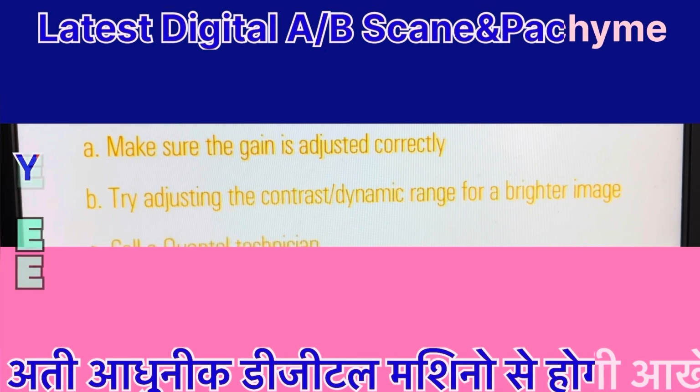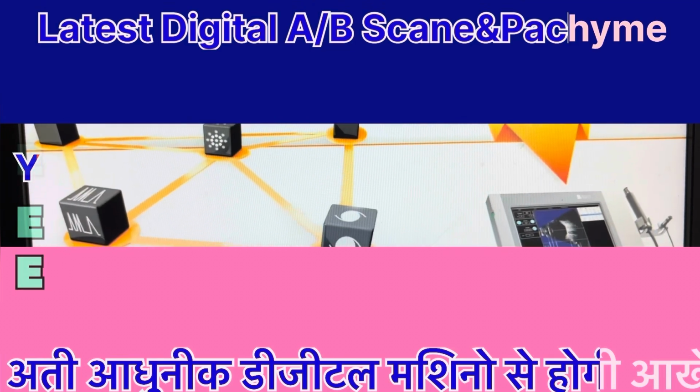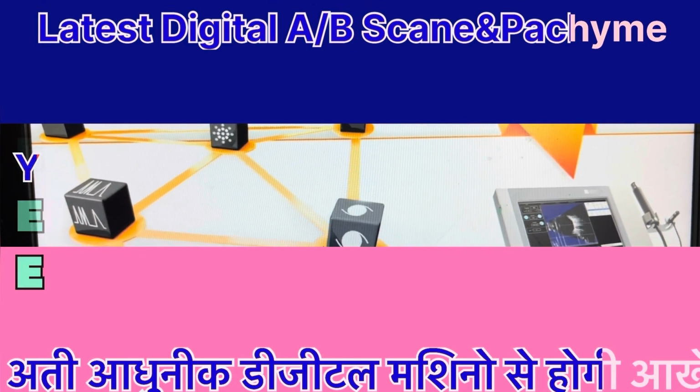With the key features of the compact touch hardware and software in mind after this initial review, we will now turn to the top 5 most frequently asked questions about this device.